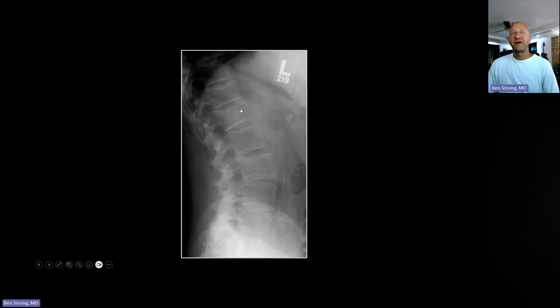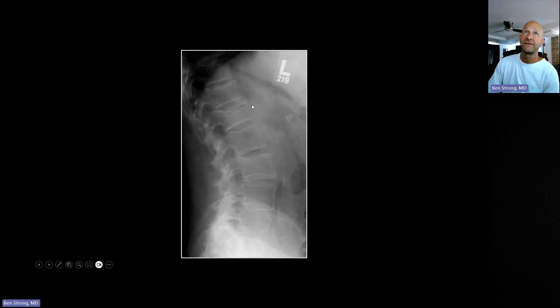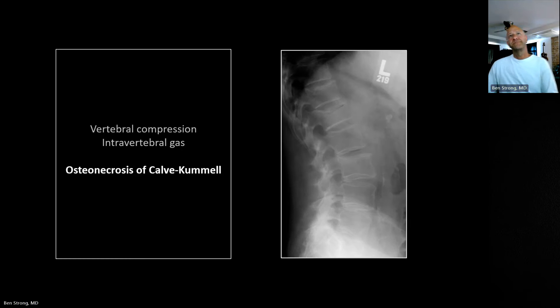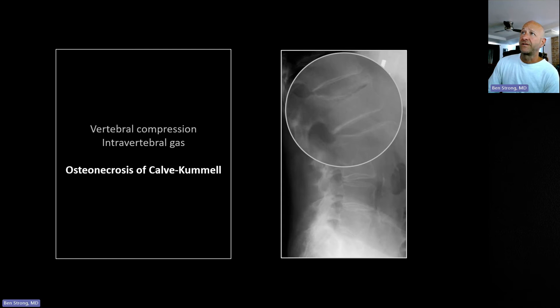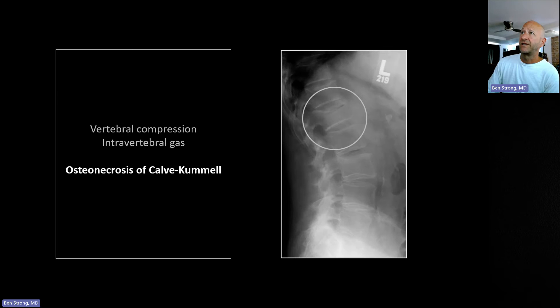I point that out because when I show this film to residents as a quiz question, they always miss it — they see the linear gas collection and write it off as disc space gas, but it clearly is not. You can see it's lying below the level of the superior end plate. This is indicative of osteonecrosis — this is osteonecrosis of Kümmel disease, almost always related to steroids or some kind of insufficiency. The important thing to note is that it is always benign; it's not a pathologic fracture due to an underlying tumor. It's a pretty good sign that all you've got is osteonecrosis.